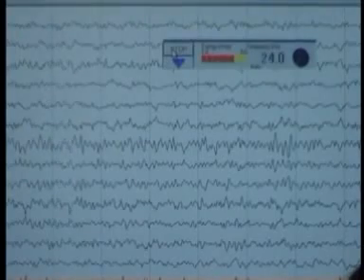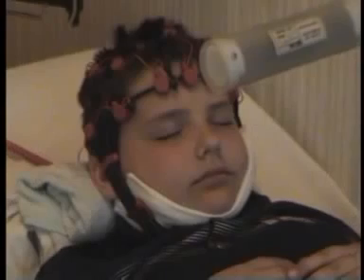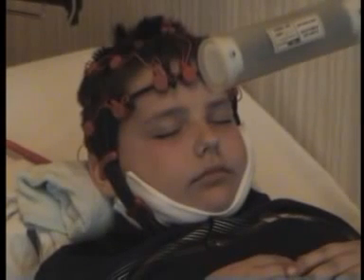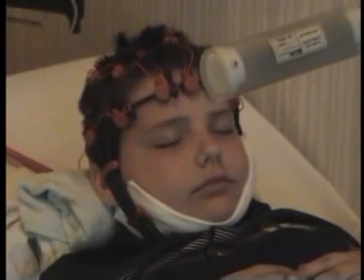Once again, I would like to emphasize that it is not permitted to use only some sizes of the cap for all circumferences of the head because it is in violation with the International 10-20 system, which leads to wrong interpretation of results. Frequent application and movement of electrodes can damage or break the rubber net, for which the manufacturer holds no responsibility.